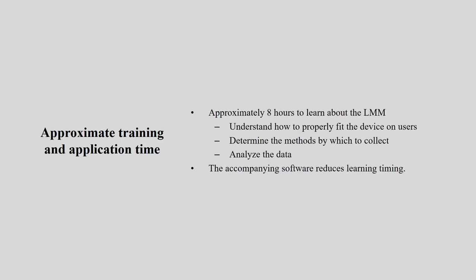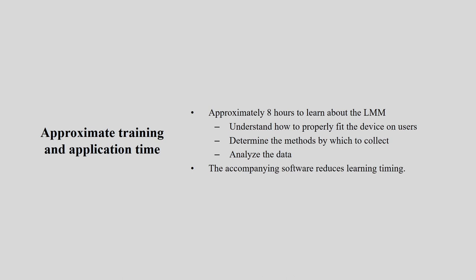Approximate timing: approximately 8 hours you need to learn this LMM, but it absolutely depends on your level of understanding, so it can vary. You need to understand how to properly fit the device on users, determine the methods by which to collect data, and analyze the data. The accompanying software reduces the learning time, but understanding that software is also an important aspect. In total, this particular instrument is a little complicated. You really need some basic understanding of lumbar movement and all those things, and only then can you use this instrument. So that's all about the lumbar motion monitor.